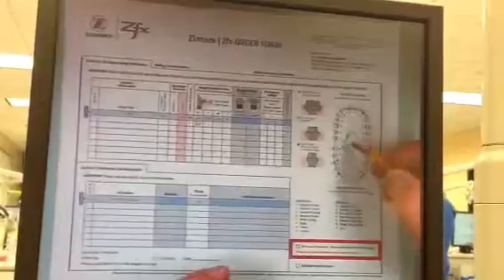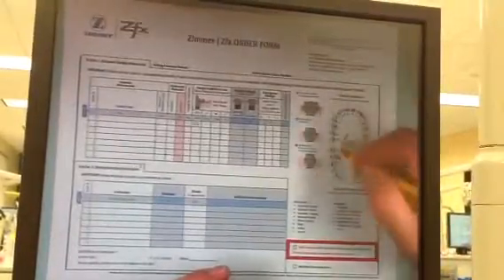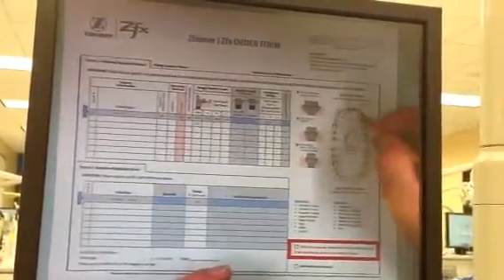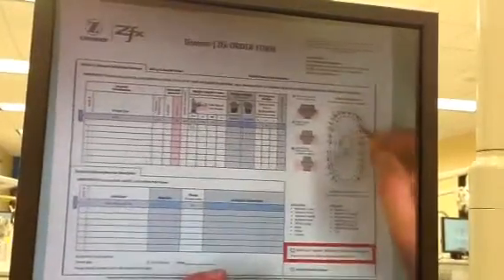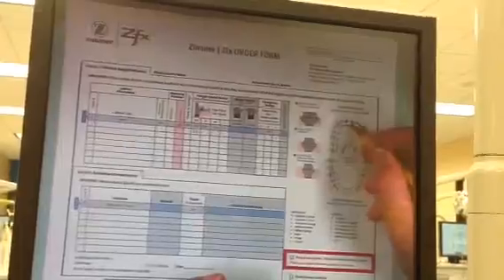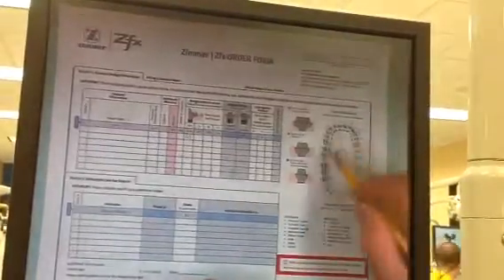Now, if you're making a bridge, and if I remember, I can show you, you can have them all be parallel to each other. I have a fixed case where I made it in 3 pieces. I have, I don't know, 7 or 8 implants where the posterior ones all draw, so those dots are connected. The anterior ones all draw with themselves. But you certainly could make it so that pretty much all of them, depending upon where they are, draw.